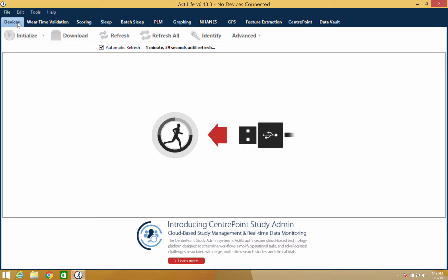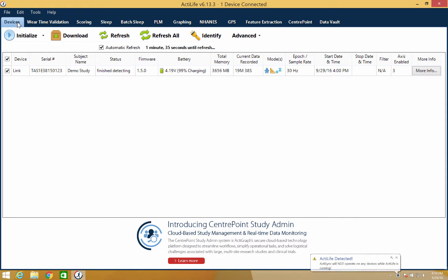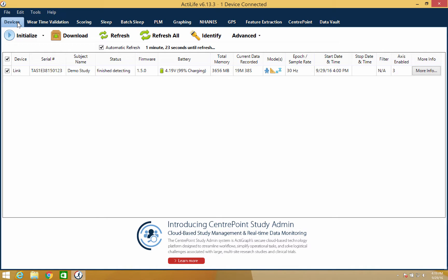Note that you can initialize multiple devices at once, however the parameters of each device will be the same. Make sure that any previously collected data has already been downloaded as the initialization process will clear the device's memory.